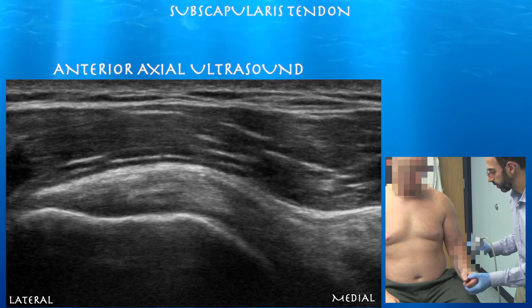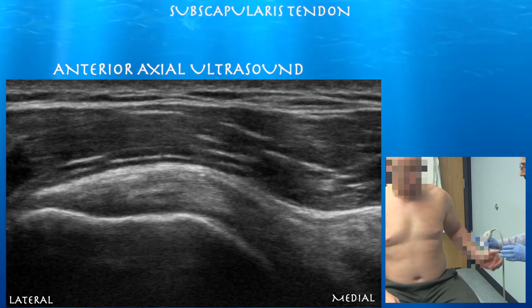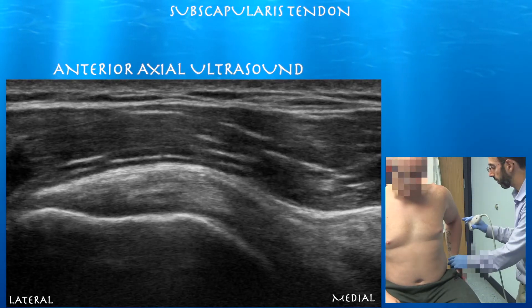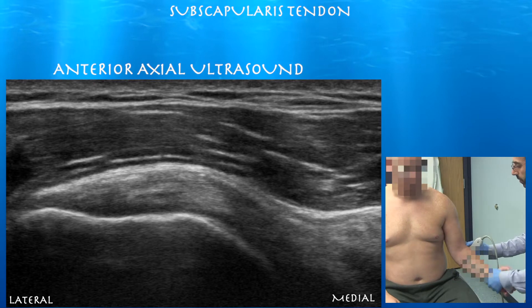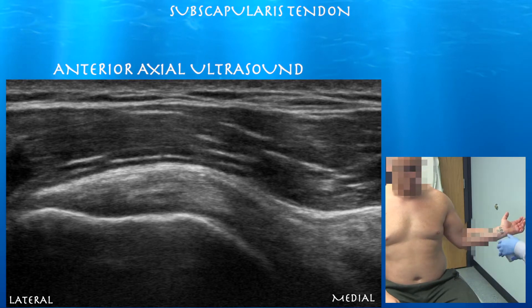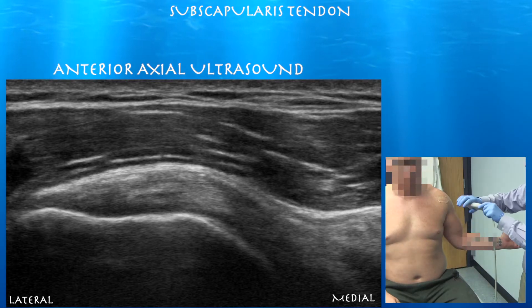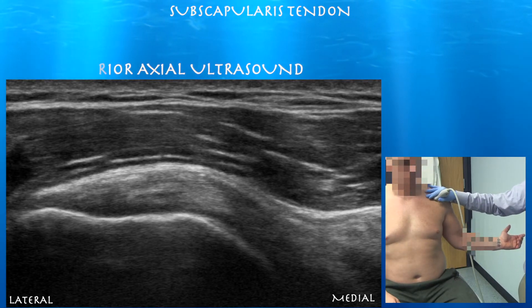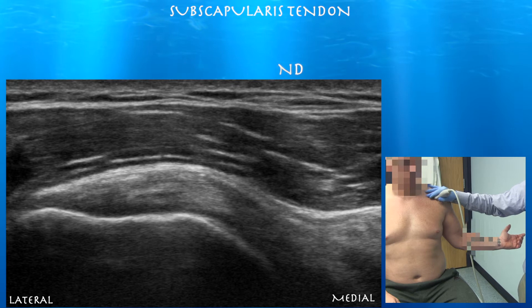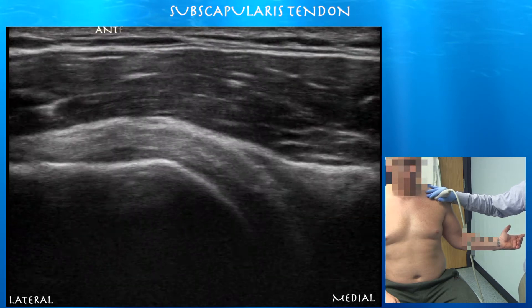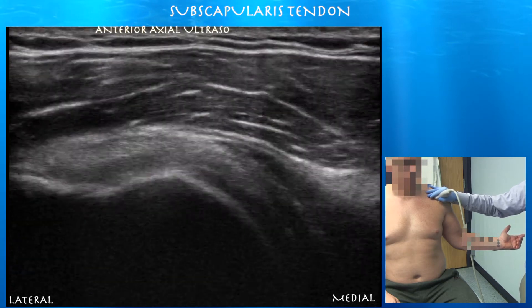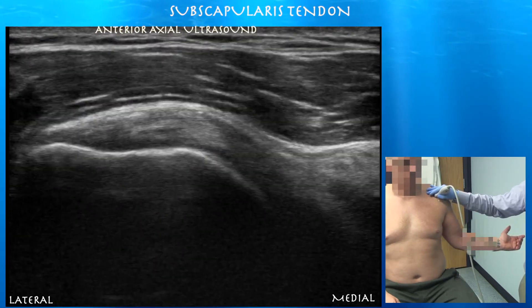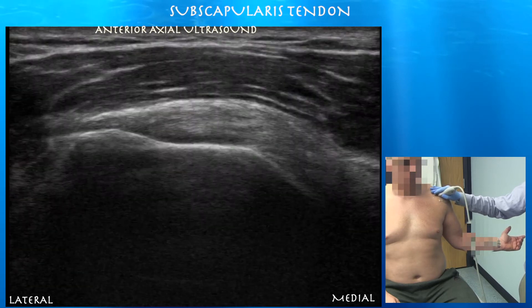Let's look at the subscapularis tendon now. We'll do subscapularis with external rotation. Right side of the screen is medial. We're at image 1812 and we can see the subscapularis tendon going into that lesser tuberosity.